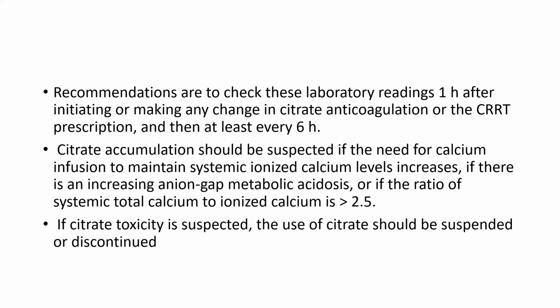Citrate accumulation should be suspected if the need for calcium infusion to maintain systemic ionized calcium level increases, or if there is increasing anion gap metabolic acidosis, or if the ratio of systemic total calcium to ionized calcium is more than 2.5. If citrate toxicity is suspected, the use of citrate should be suspended or discontinued.